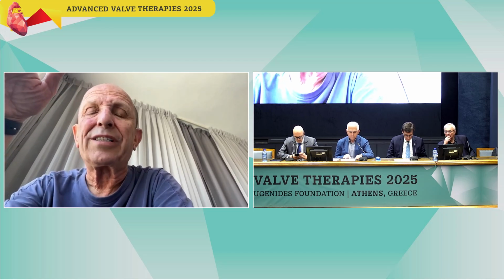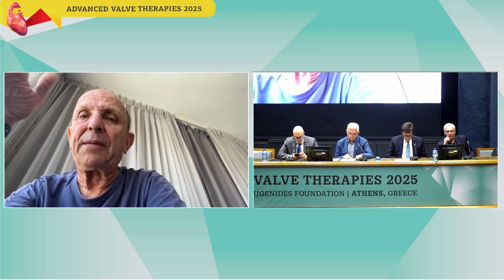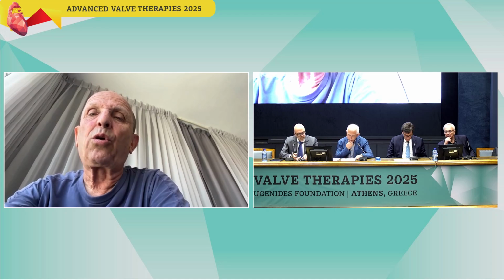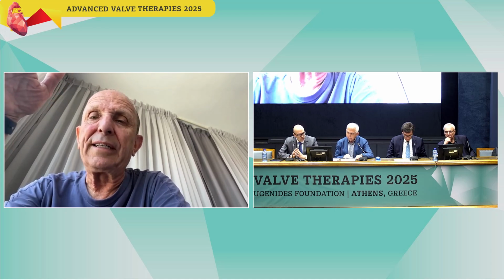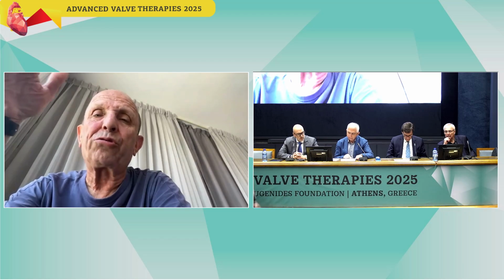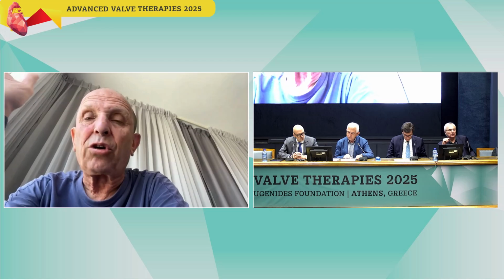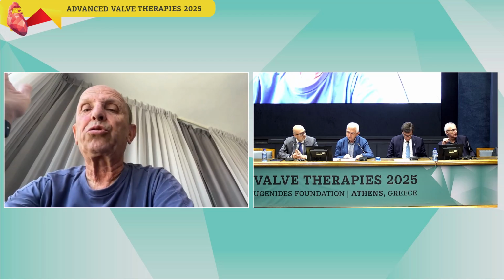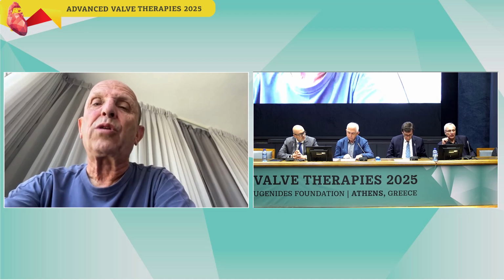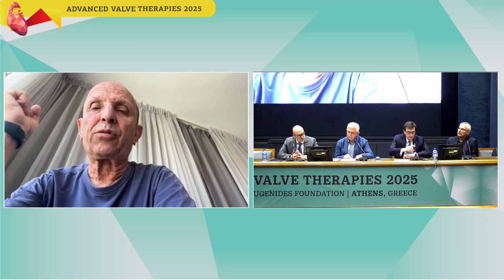You cannot argue with success. You made a beautiful implantation with a beautiful result. I'm just saying that you can take either a balloon or a self-expandable valve for those cases. The excuse not to use a balloon expandable because it's heavily calcified, etc., is not an excuse anymore, because you do not compromise on less than a beautiful result, and you will do a post-dilatation with a bigger balloon. You understand? That's what I'm saying.